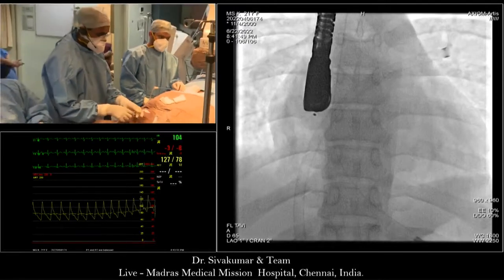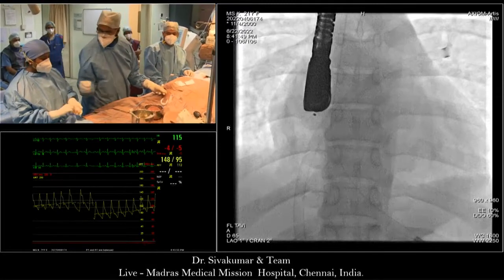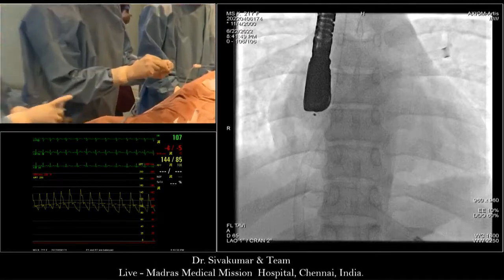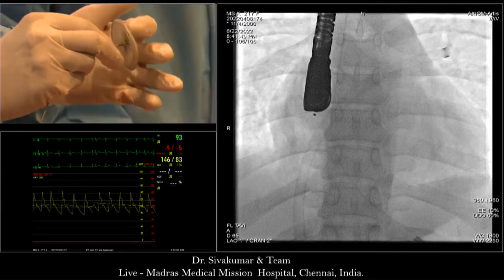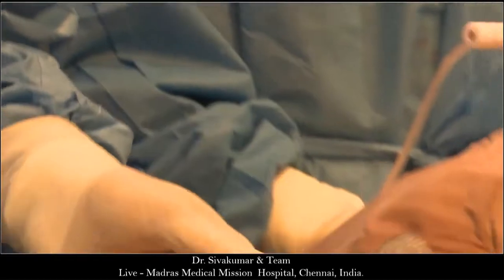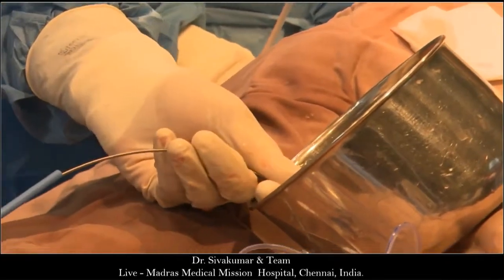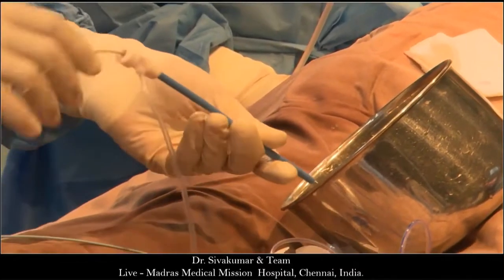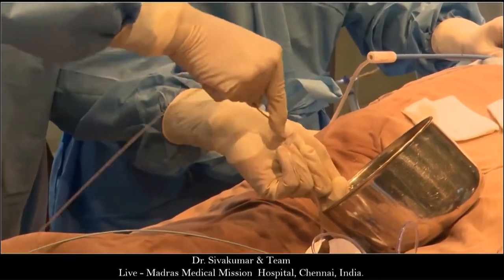In support of Bharat's comment, I think the measurement of the waist gives more information. The heparin was given about 40 minutes before, Bharat. Do you check ACTs or just keep copying? We check it if it is more than 1 hour. Within 1 hour, 100 units per kg we give, and that's it.